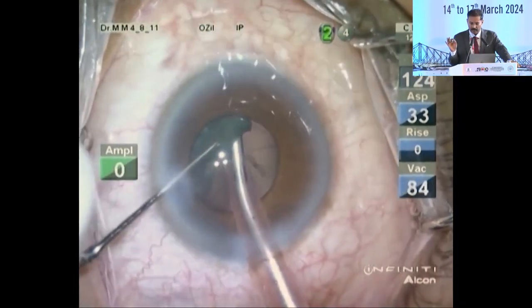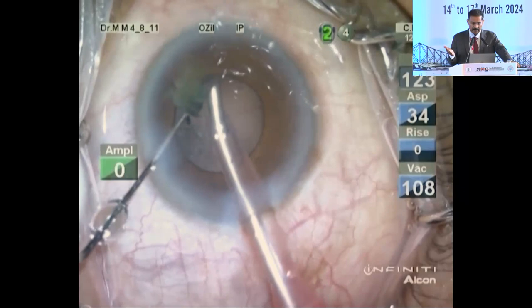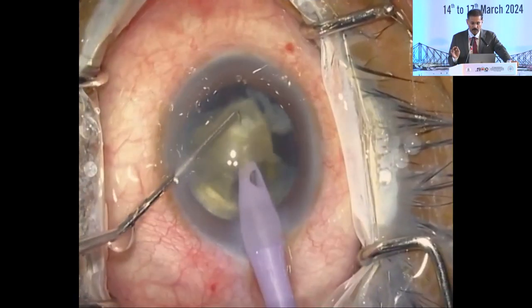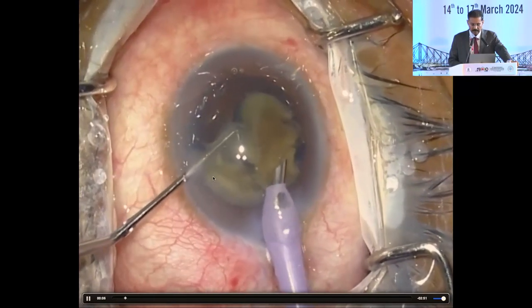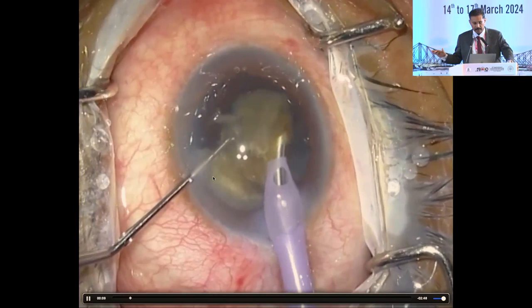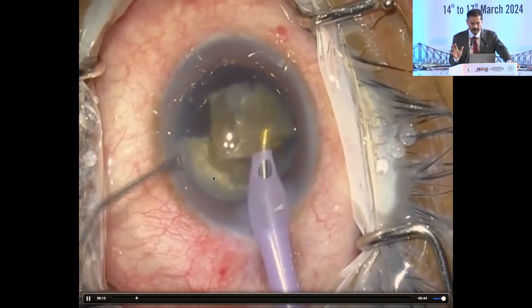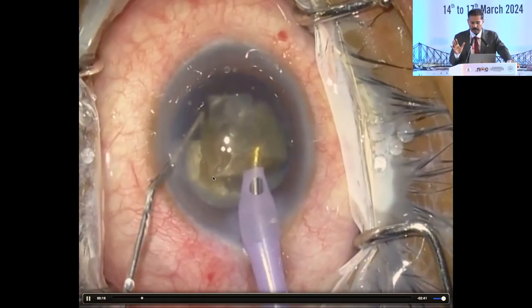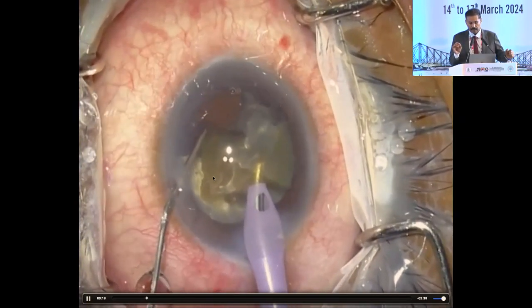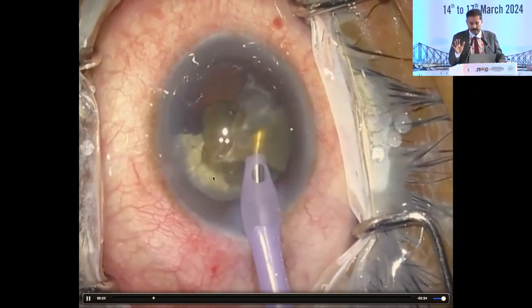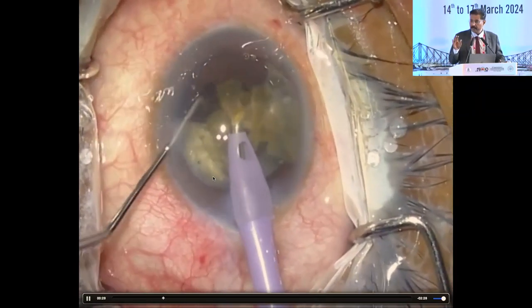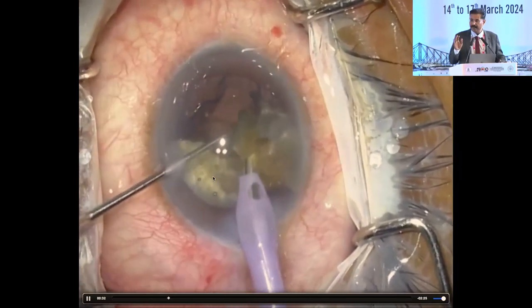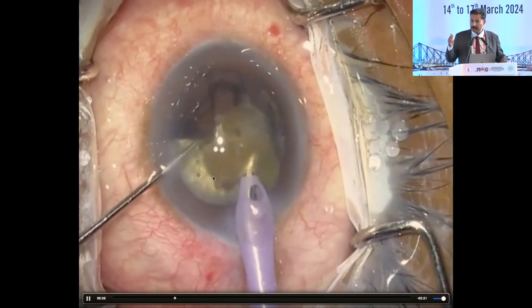Things are going very slow. It is being done away from the area of rupture, especially in the anterior chamber. I am lucky that nothing fell down through the open capsule. Look at this piece of nucleus — this is half the nucleus here, almost disappearing in the pupillary area, meaning there is some posterior capsule rupture behind. So I stop and wait and don't take out the irrigation or your FACO probe. That is the first thing to do. Fill up and push down the capsule or vitreous if it has come up with dispersive viscoelastic. Here there is no vitreous, so with dispersive viscoelastic I reduce my vacuum and, most importantly, reduce my flow rate.